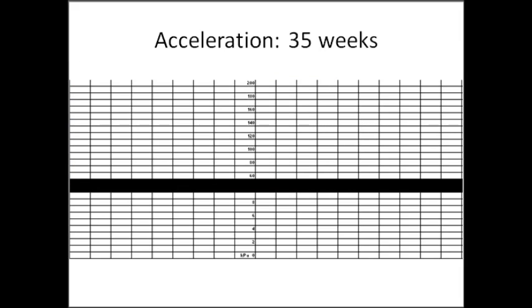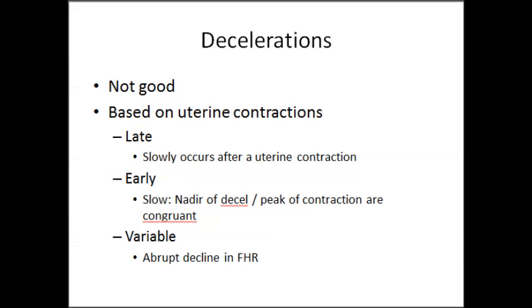Alright, so that is everything you should basically know about accelerations. Decelerations, on the other hand, are not good. So accelerations are good, decelerations are not as good. These are based on uterine contractions as well.